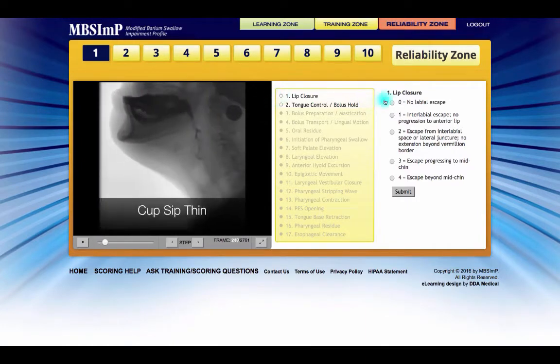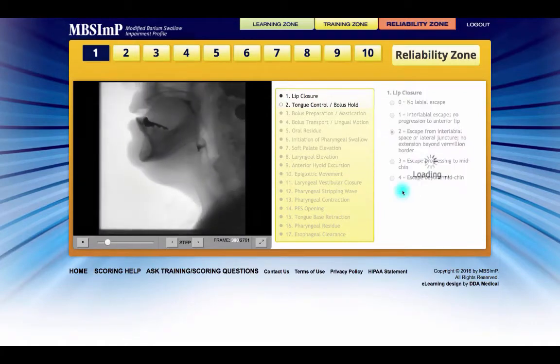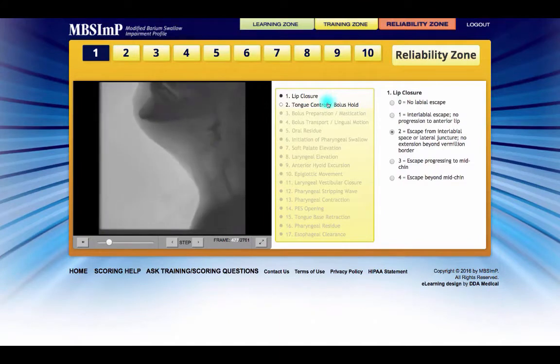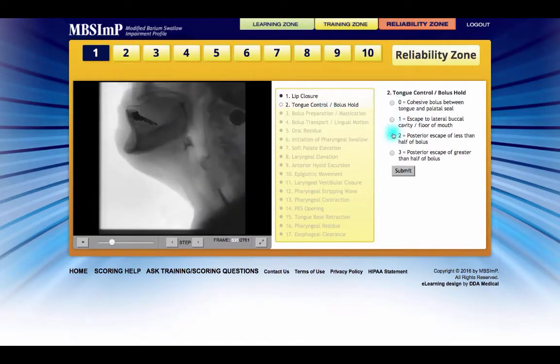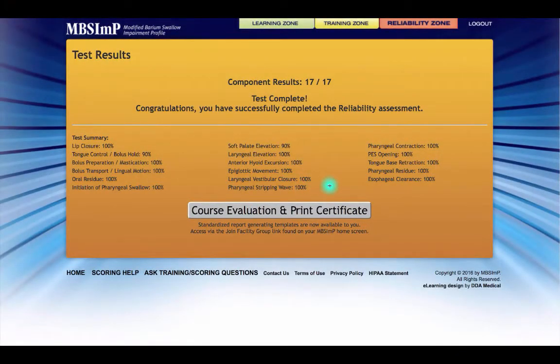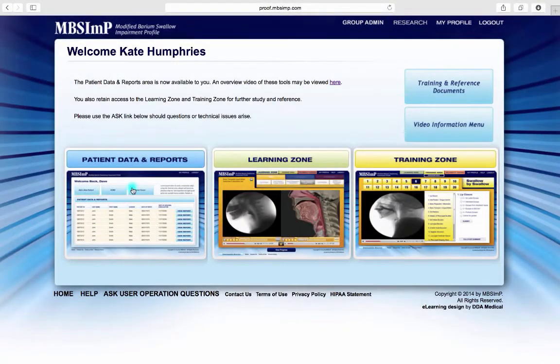During retesting, components that have already achieved the passing criteria of 80% accuracy are grayed out. Once a user has successfully achieved the reliability criterion, notification of the success is given and a link is provided to complete a course evaluation and print the certificate of completion. Once the designation of registered MBS-IMP clinician is earned, immediate access to the MBS-IMP interface for patient management and report generation is provided.